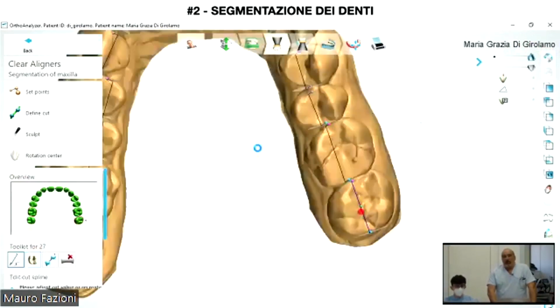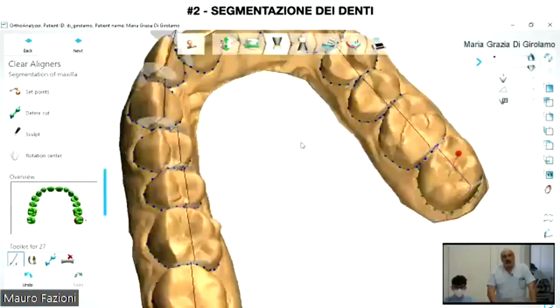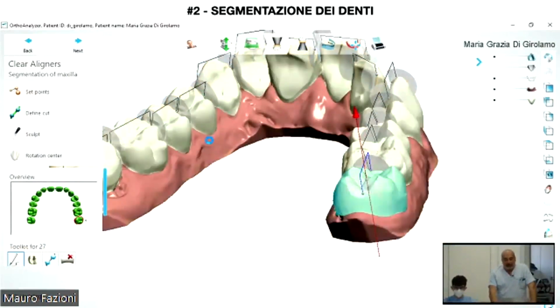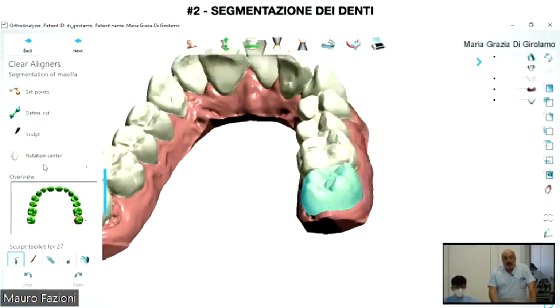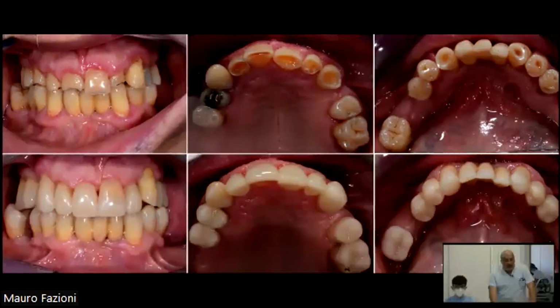Because more than half of our work will be aligning teeth before prosthetic solution, restoration, restorative, direct restorative, or prosthetic. Here you can see a software where the teeth are moved. We can move the teeth regarding the correct design of the morphology.